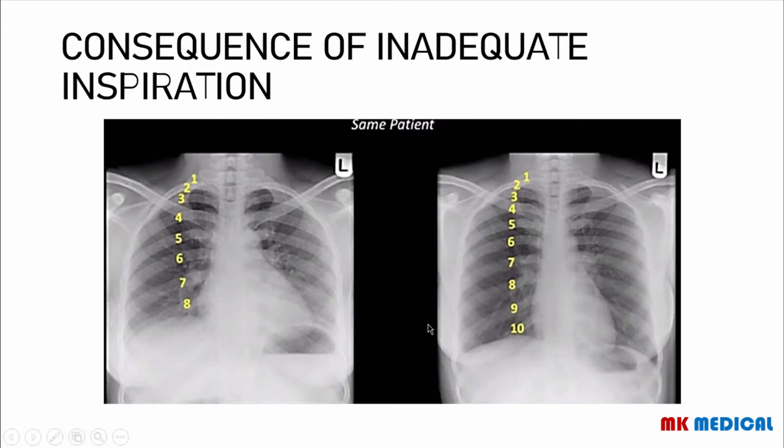And take note also of this breast tissue here. Don't confuse this and ask what this is. This is simply because this was taken in a woman. So this is an X-ray of a woman.